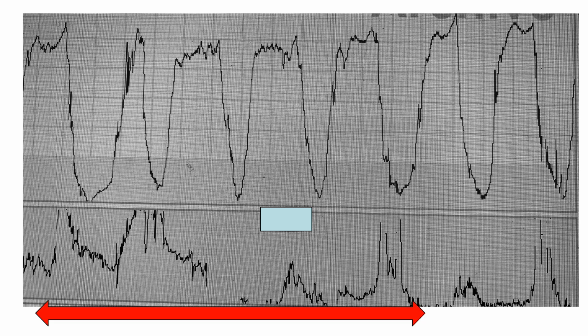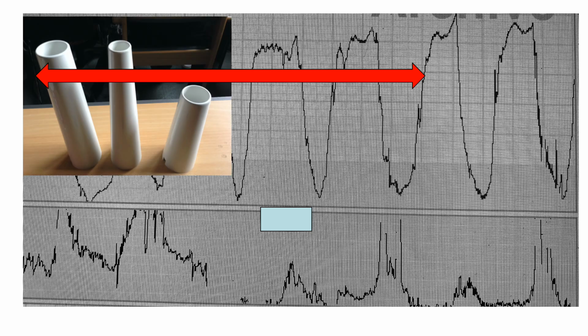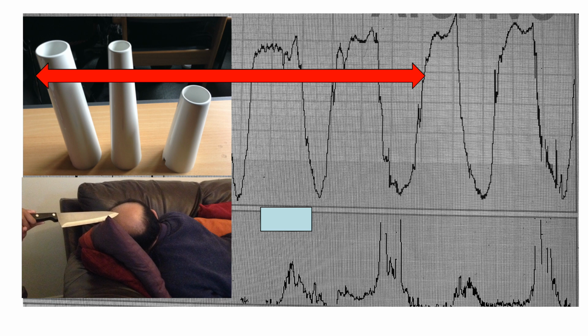So please look at the CTG trace. Some obstetricians may be tempted to use pattern recognition guidelines and to call it a pathological CTG because the atypical variable decelerations are continuing for 50% of the contractions for 30 minutes. And therefore they may be tempted to take some tubes and cut the skin of the scalp of a fetus.